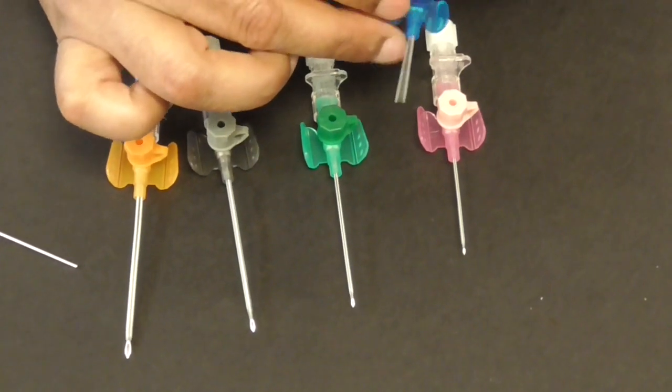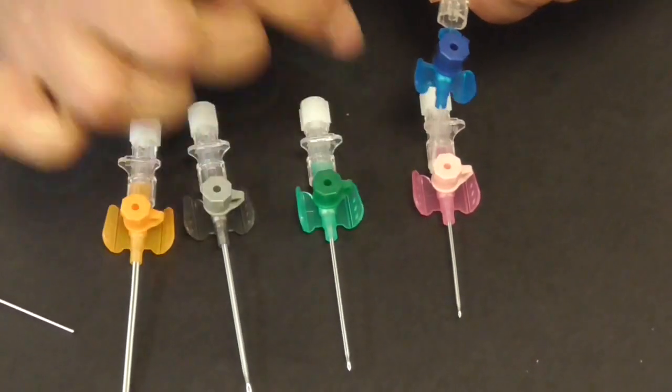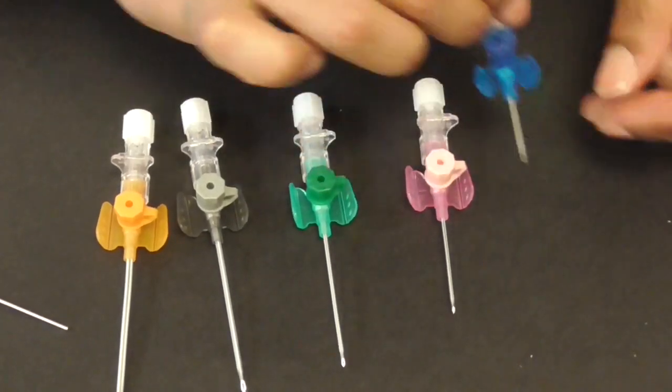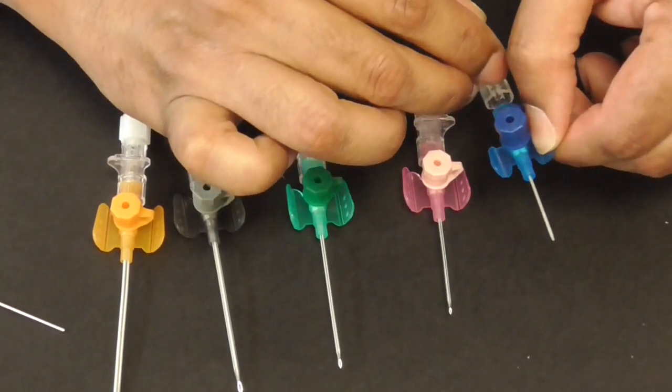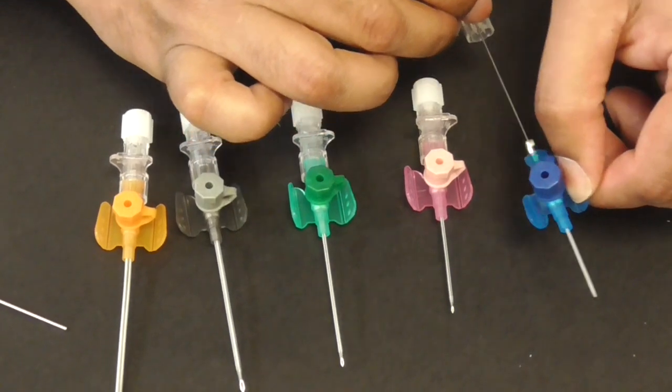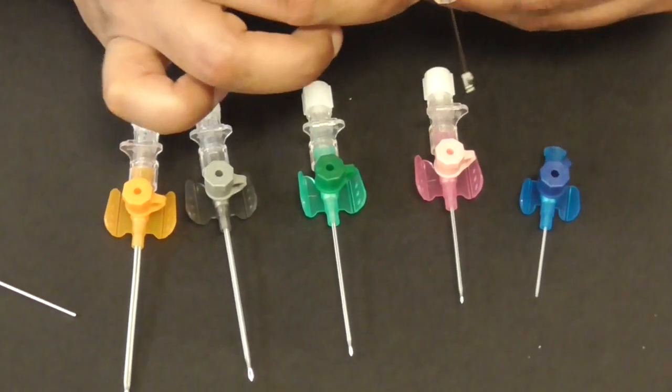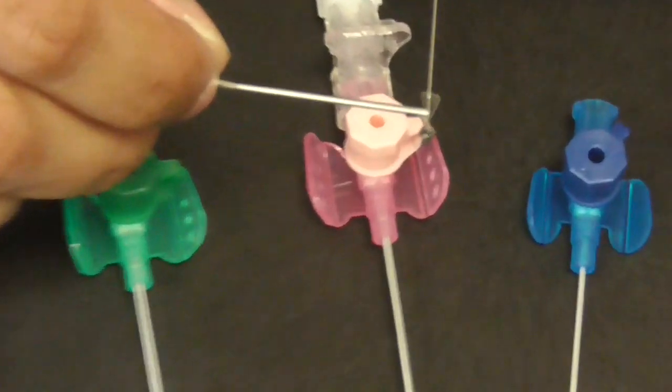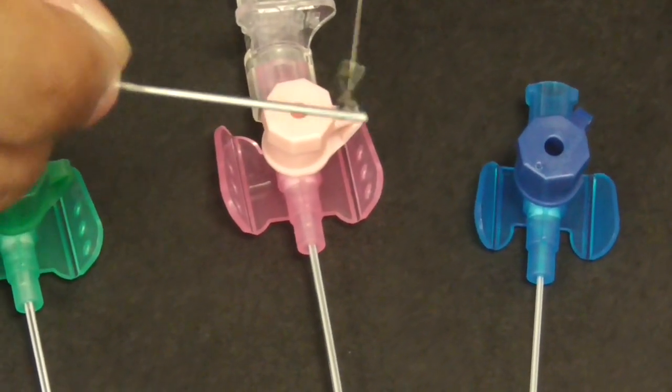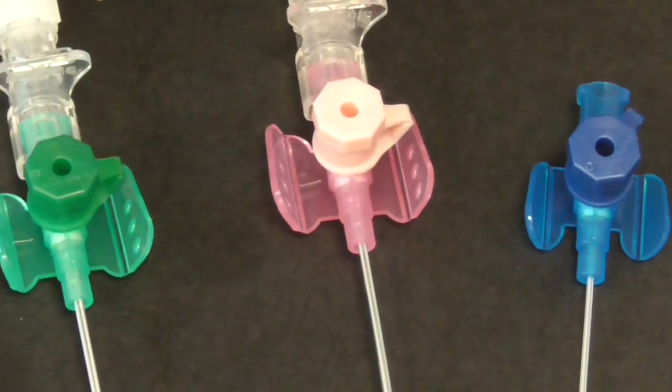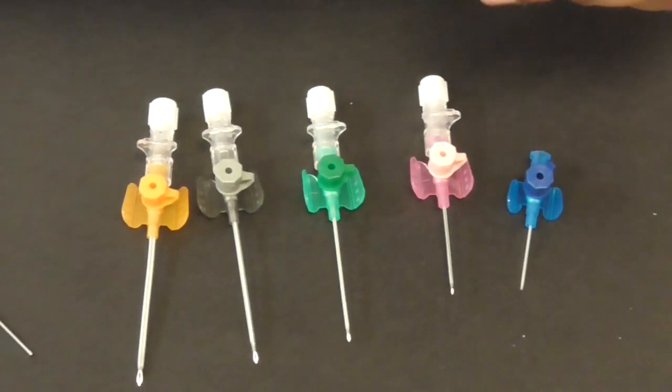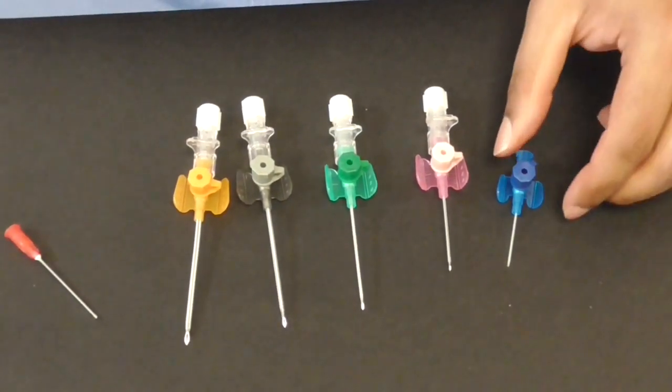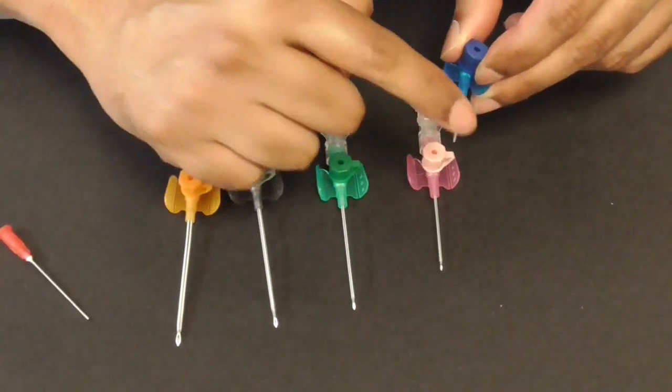So the stilette or trocar is withdrawn the cannula which is the plastic bit is left behind. Now in the old days when you took the trocar out then you have this pointy thing that could hurt you but nowadays you've got a very clever little mechanism which sheathes the pointed bit of the trocar which is like a needle so that you don't hurt yourself. Notwithstanding that once you've taken this out very promptly take a sharp bin and put it, did you hear that, it's gone into the sharp bin.